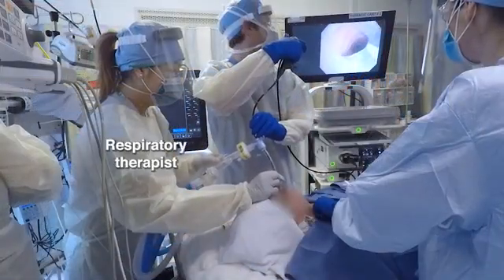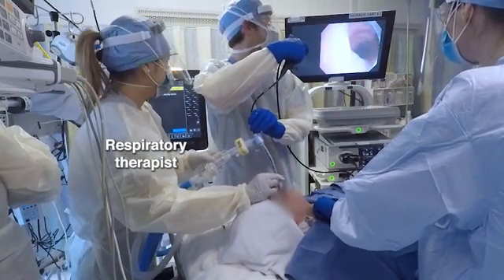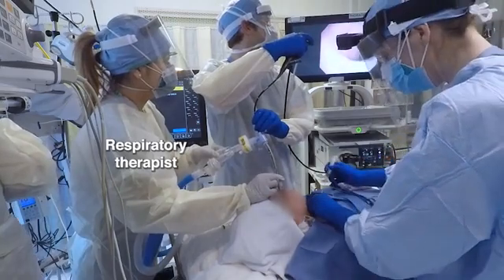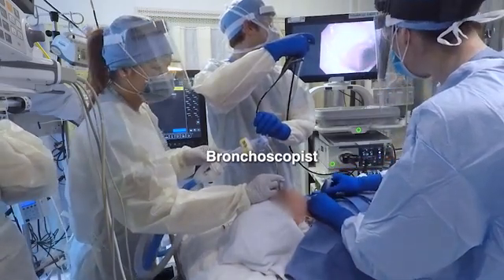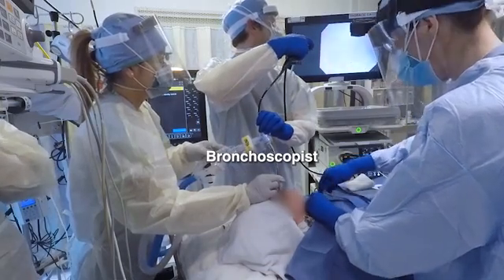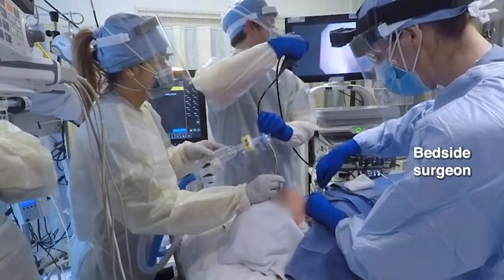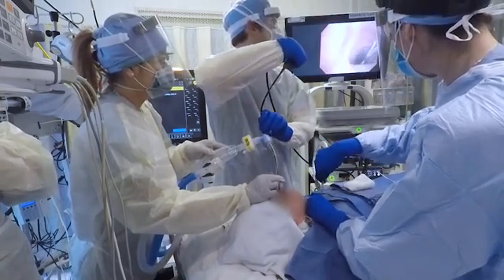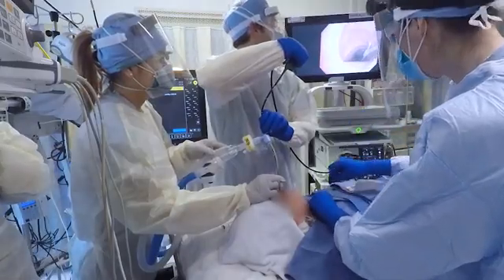The respiratory therapist should stand at the head of the patient's bed, where the therapist will have direct control of the airway and access to operating the ventilator. Position the bronchoscopist at the patient's left side, next to the bronchoscopy cart and video monitor. The surgeon should be on the patient's right side, with direct view of the bronchoscopy monitor. However, a left-handed surgeon may prefer to be on the patient's left, with the bronchoscopist on the patient's right.